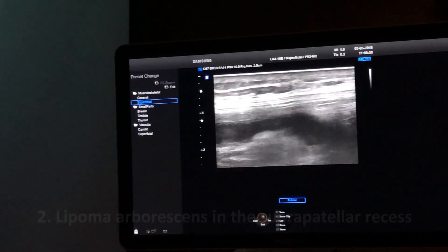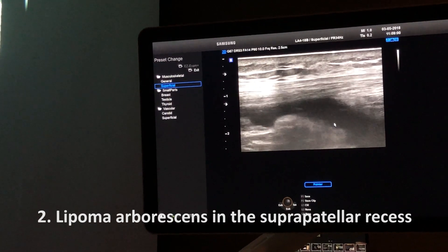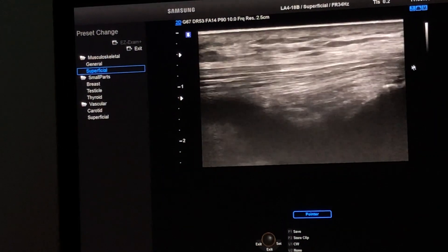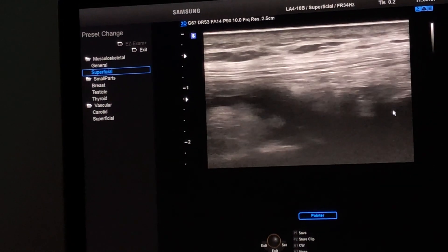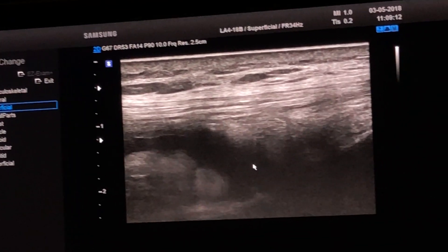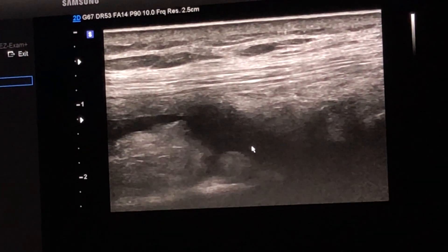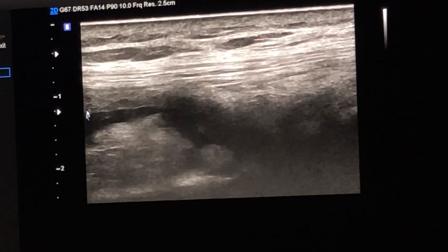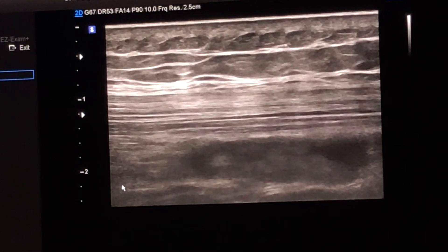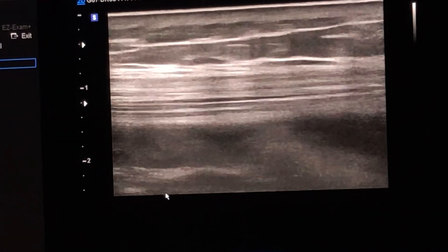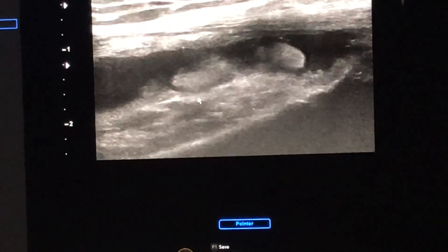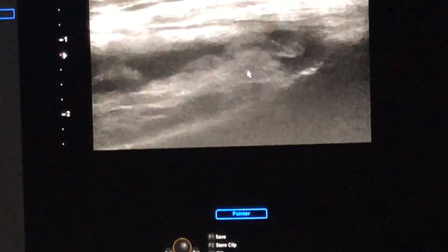We have more abundant fluid at the level of the joint recess. I place the patella here, the upper pole of the patella close to the border. How is the amount of fluid — moderate or severe? It's severe because the image of the recess is cropped and the distension is more extended than the width of the probe. When we go to scan the lateral aspect of the joint, we see this kind of image.